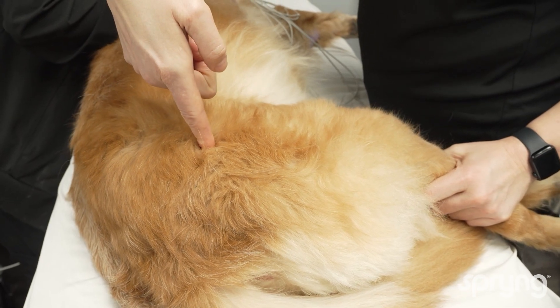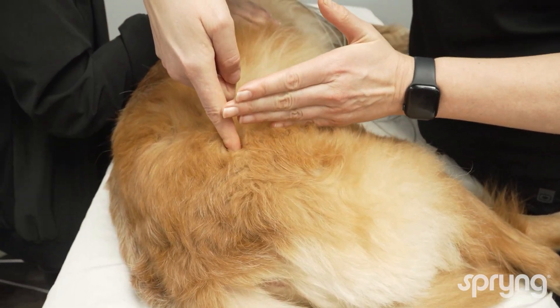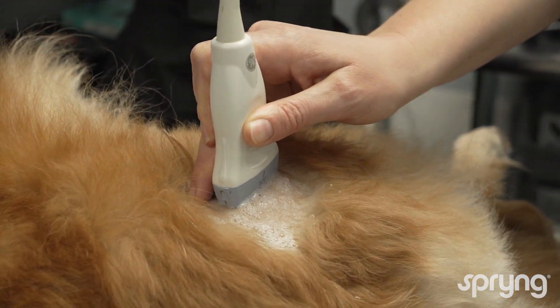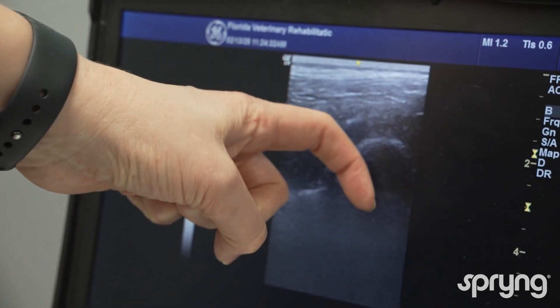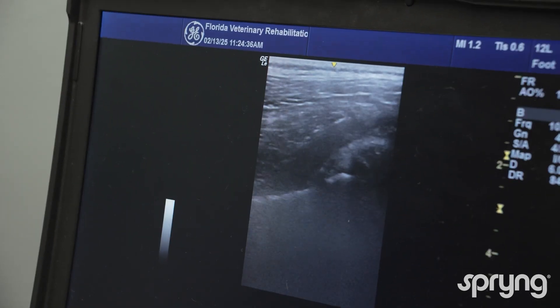Remember to avoid the caudal aspect of the joint due to the proximity of the sciatic nerve. Using an ultrasound, we can identify how deep the joint is going to be and visualize the landmarks. Identify the greater trochanter of the femur and note the joint line is deep to the proximal aspect.